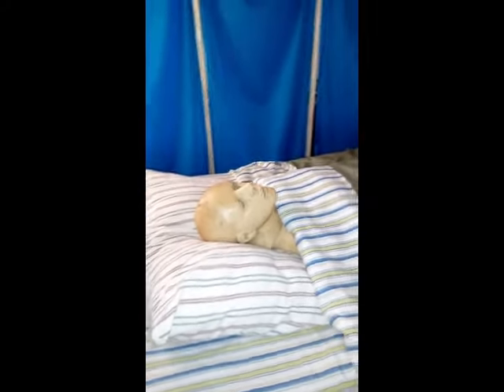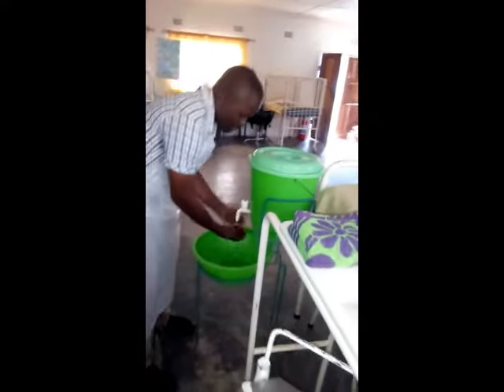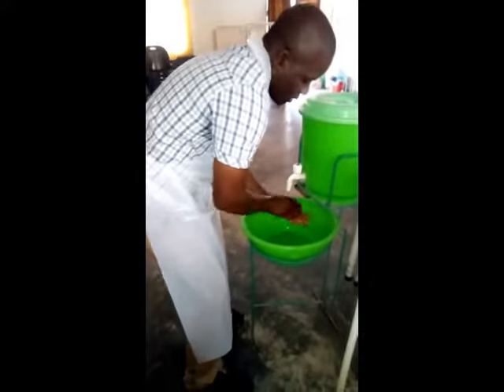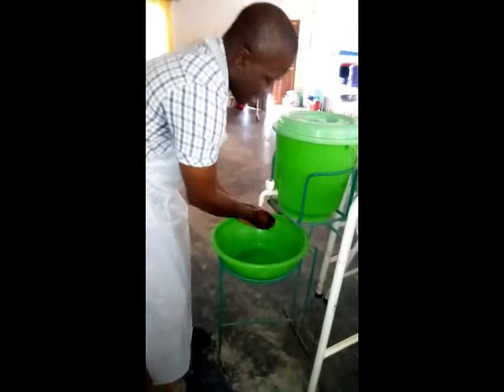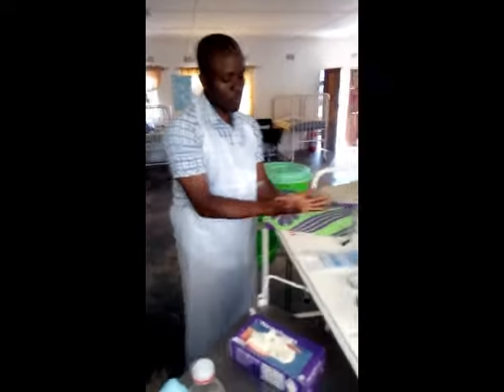You go there, get soap, and wash hands as usual. There is a procedure for hand washing, which we demonstrated last week, meaning you really need to hand wash.